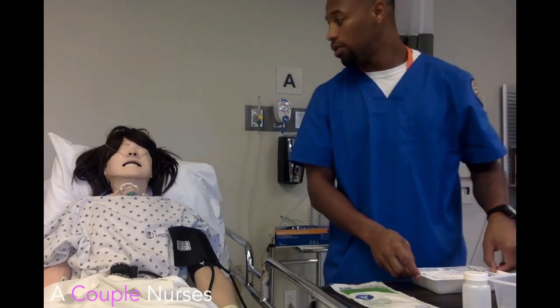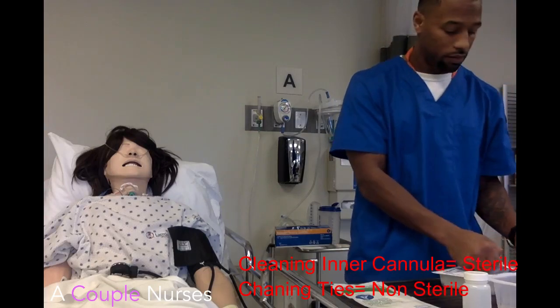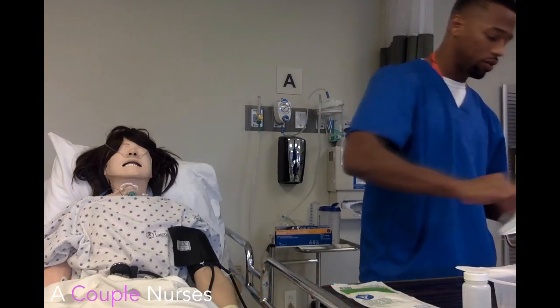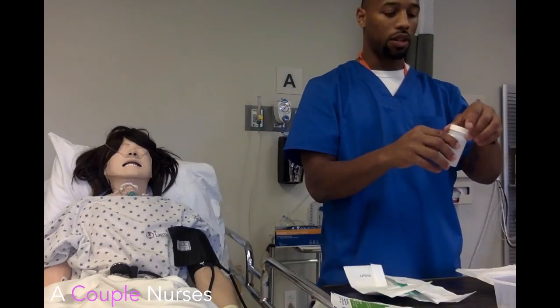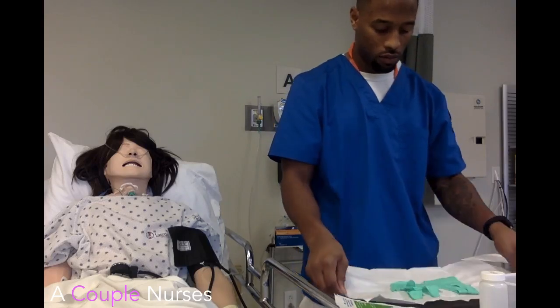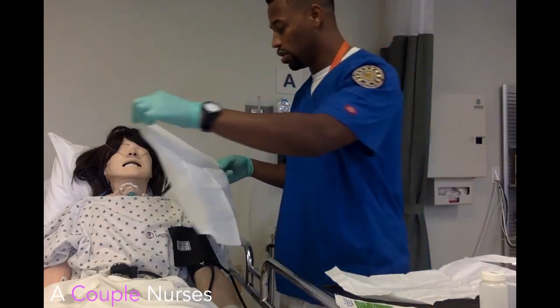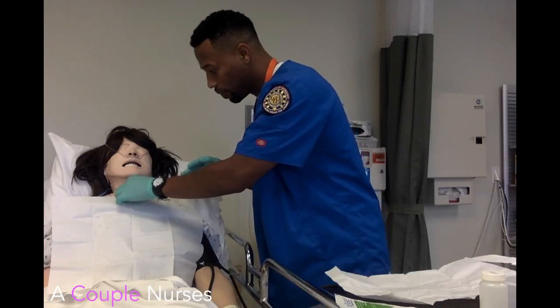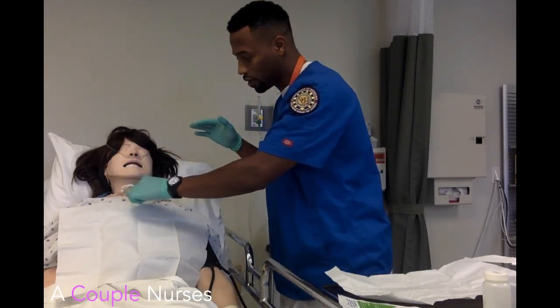We've done the inline suctioning; now we're going to do some cleaning to make sure everything is looking okay. The only sterile part of this portion of the procedure is actually cleaning the inner cannula. We're going to maintain our sterile field and take the top off. You have to pull it really hard, or if you do suctioning and it's not clipped in, it just comes out.